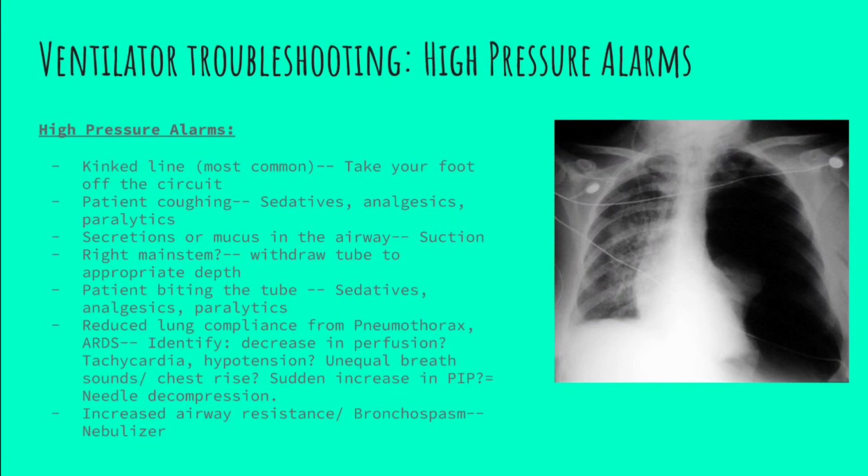So another thing that can cause this is the patient biting the tube. Now, once again, give the patient something to sedate them, give them analgesic, and this should fix the problem, right? It should, in all honesty, be very difficult for a patient to bite their tube. If we're using commercial securement devices, they all have a bite block, so you shouldn't really run into this issue, although I have seen it.